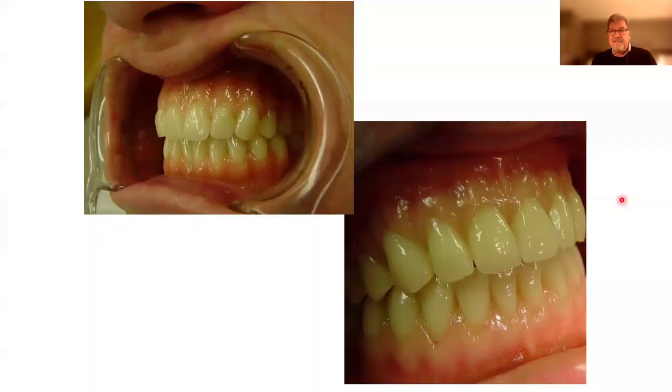And this is the final denture in the mouth. Beautiful denture, right? Looks good. Nice denture-base stain. And it's very rewarding when you're in the operatory working with a doctor and the doctor doesn't have any adjustments and the patient can walk out of the operatory very pleased.